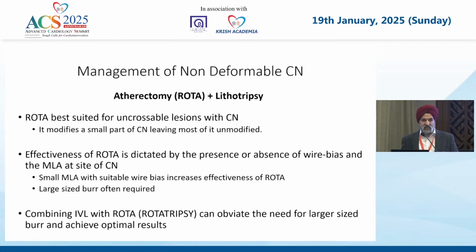Now let's look at some non-deformable nodules. Now atherectomy, as I told you, if it's non-deformable, atherectomy is of choice. Rotablation is suited for uncrossable lesions. So rota is the only front cutting device. So if you get into a situation where you cannot put anything across, it's rota which is going to bail you out because this is a front cutting device.